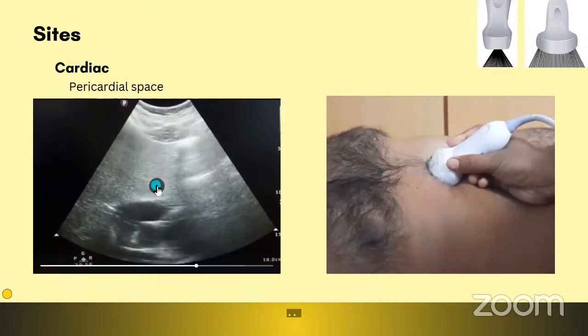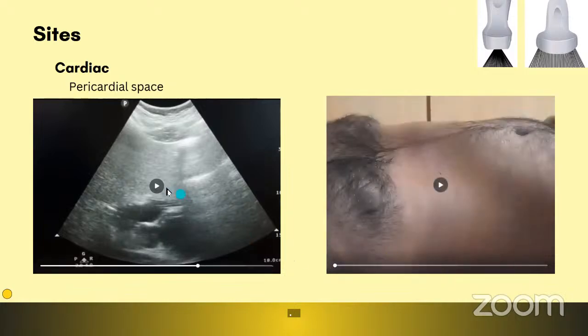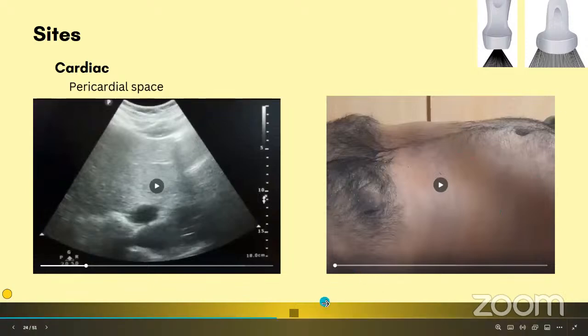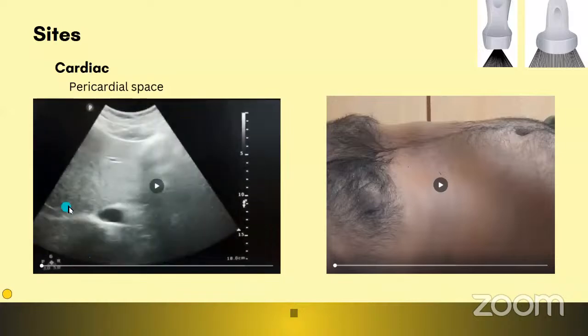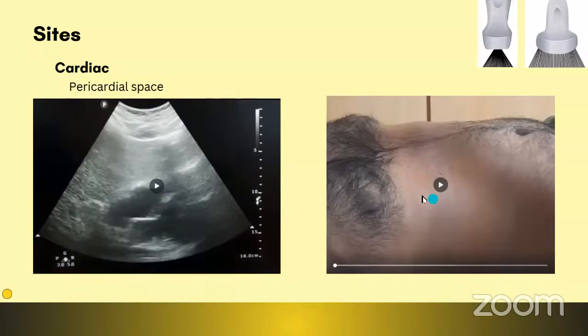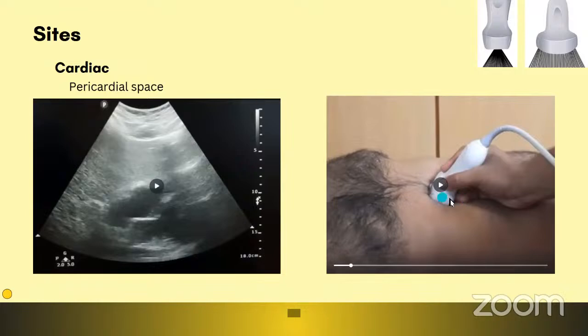So, okay, for information, these two images were supposed to synchronize, but they are not. And thus, for the following sites too, my recordings are asynchronous. So please do not try to synchronize the movements of the probe with the images here. Yeah, don't subconsciously do it. So you can see only the images separately. This probe movement is just to show how I'm handling the ultrasound probe.